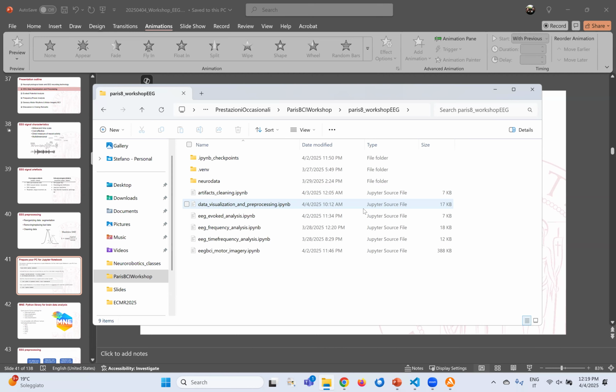So we need to extract the document. The first thing you need to do is go to the folder that you just downloaded and extract it. So that is like a normal folder, not an archive. And then we need to link this folder to our Python editor. You have 2 choices for that. Either if you already work with Visual Studio Code, or any Python editor that would work with Jupyter, it's fine.